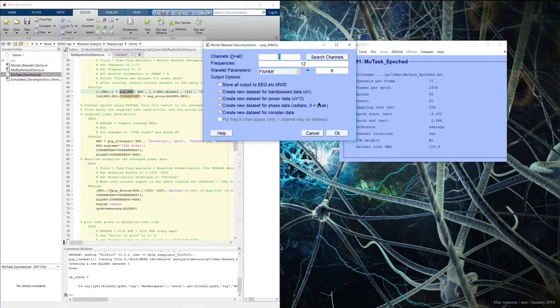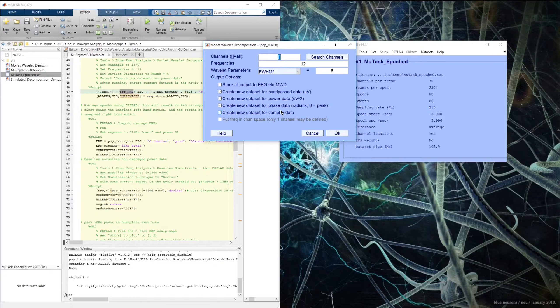For the phase output, I make a point of specifying that zero radians is a cycle's positive peak — meaning phase is in terms of a cosine rather than a sine function. A few days of my master's thesis were eaten up trying to figure out why I couldn't replicate results of certain papers that didn't mention they were reporting phase in terms of a sine function. The complex data contains bandpass, power, and phase combined. Be very careful using this function because each option creates a whole new dataset for every wavelet frequency defined — if you define 20 wavelets with three options selected, you'll end up with 60 additional datasets. Using the complex data set output can cut this by a third and still retain all of the data.